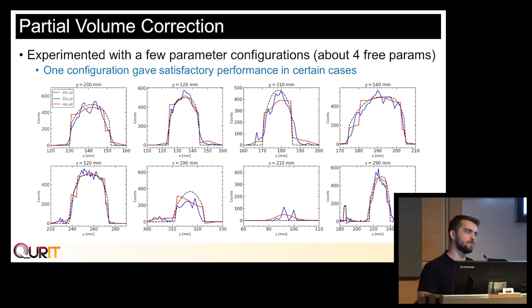What you want to do is remove the leakage, but of course there's still leakage in some of these images, even though the boundary is matched like that. One interesting thing is you can see on this bottom right image, there's a black line here that represents a known small tumor. The blue missed out on it, but the partial volume correction was actually able to get it. This suggests that in some cases, partial volume correction can be used to get the true concentration, even though it might be missed using just the algorithms that I talked about before with no partial volume correction.